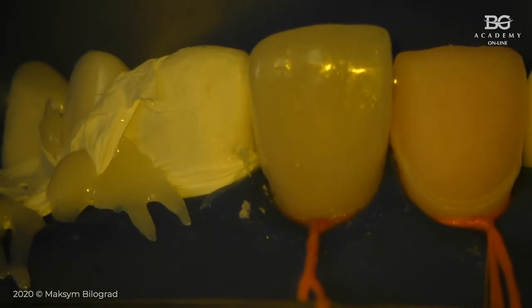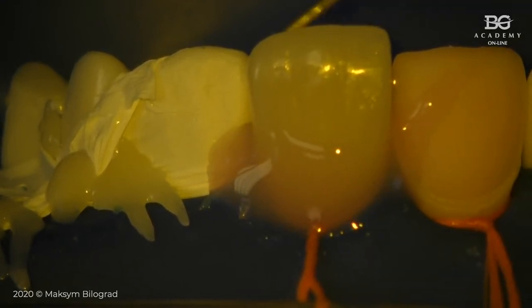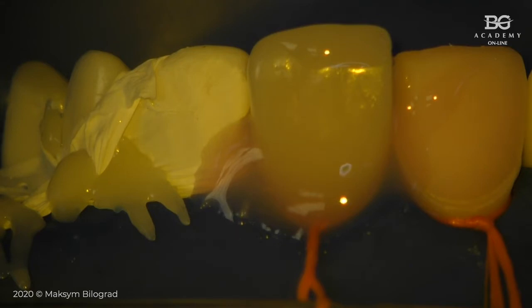Then I will put some glycerin gel from this area and also from palatal side. Glycerin we use just to create an environment where the final light cure will be done without oxygen. So cement that is underneath this glycerin gel will be light cured without oxygen, and there will be no oxygen inhibited layer.